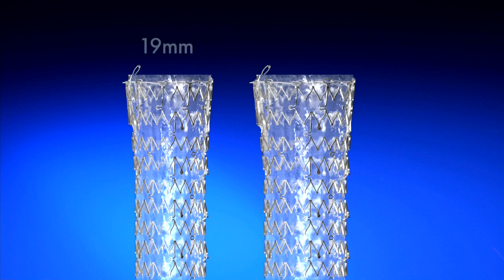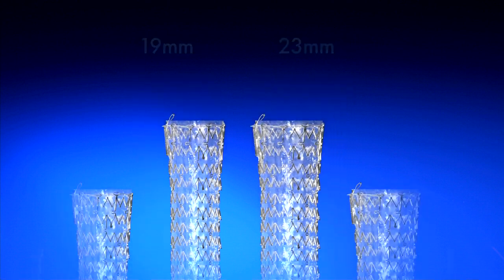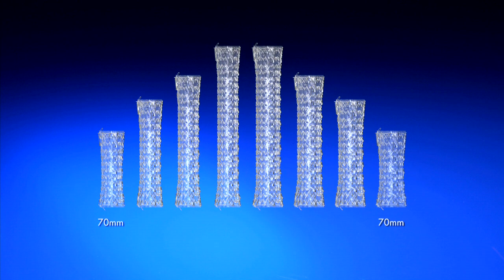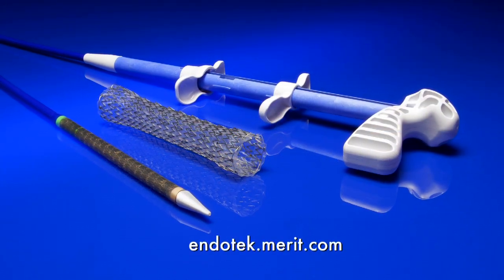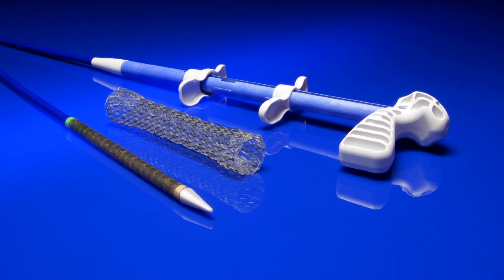The Endomax is offered in 19 mm and 23 mm diameters and lengths of 70, 100, 120, and 150 mm to accommodate a broad range of anatomical and stricture sizes. The Endomax fully covered esophageal stent system — continuing to expand the possibilities.